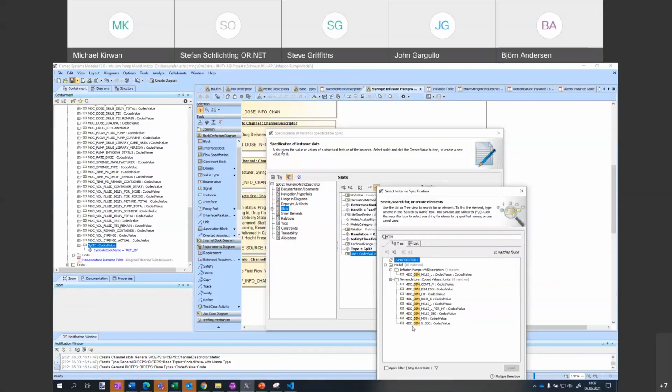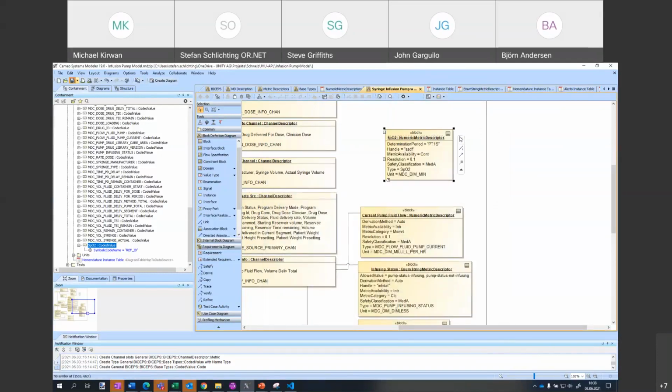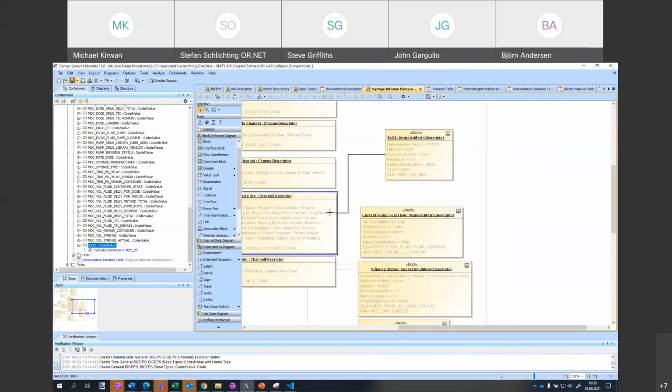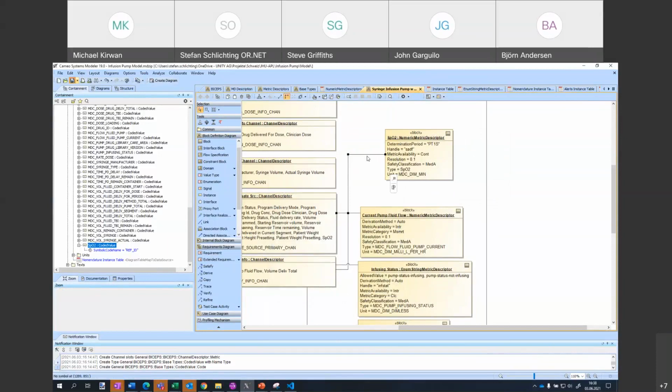So let's say, no, I don't have any meaningful unit. I just take any, and that's now, and then we just add it to any channel. It says, okay, do we want to add it as a metric? Yes, we want to do that, and now it would be generated. Excellent. I just wanted to see how easy or helpful. Yeah, once you have imported the nomenclature, the modeling is pretty simple. Well, this is tremendous. So that's great work. Thanks so much, Stefan. You're welcome.